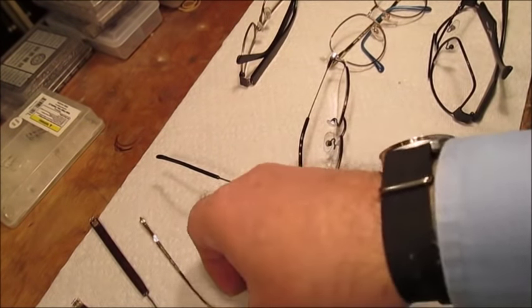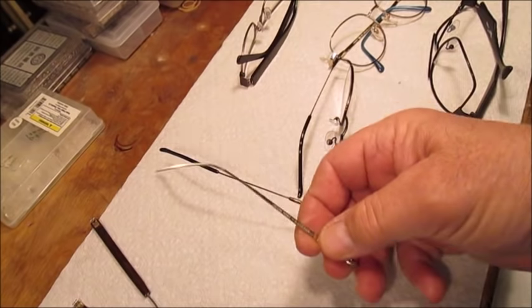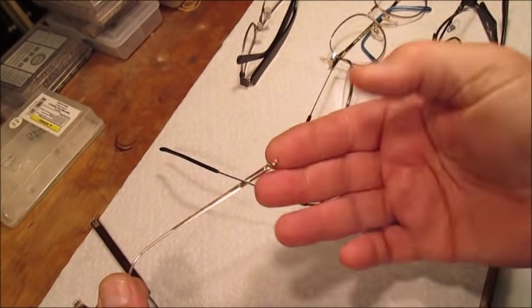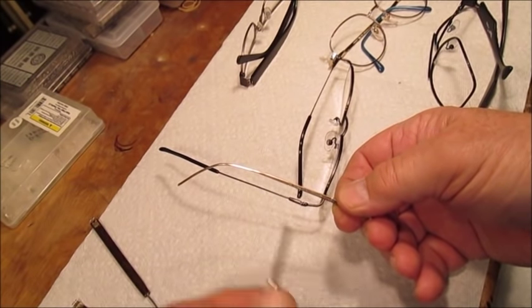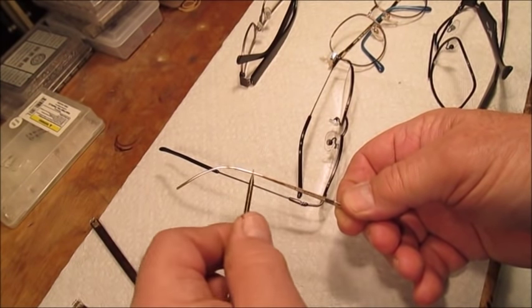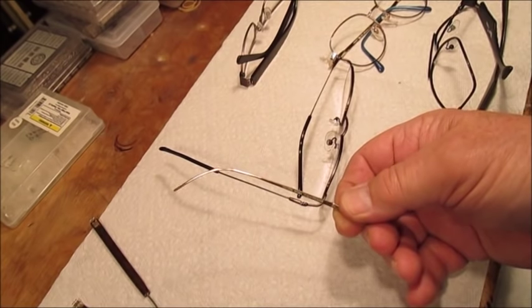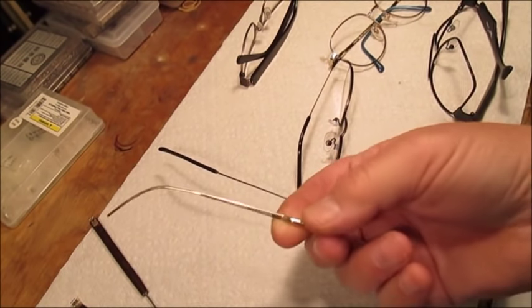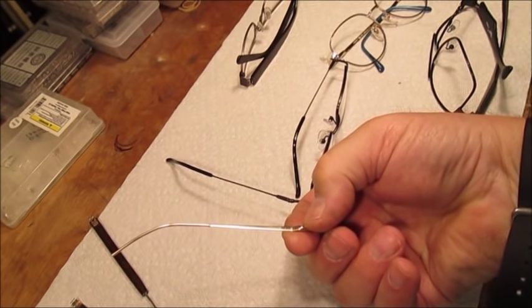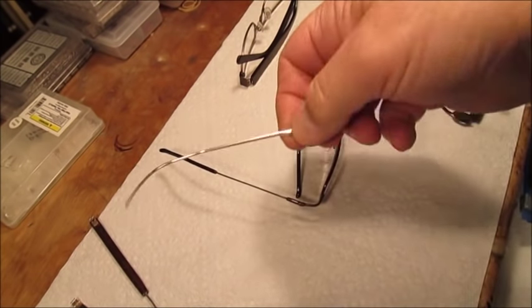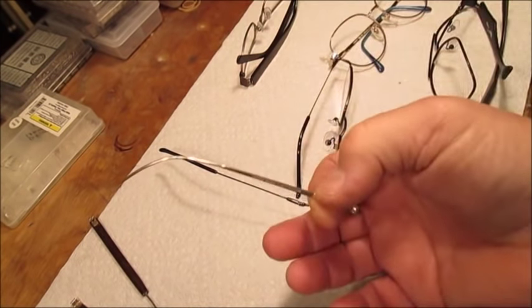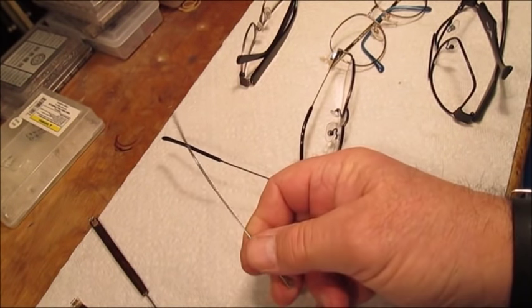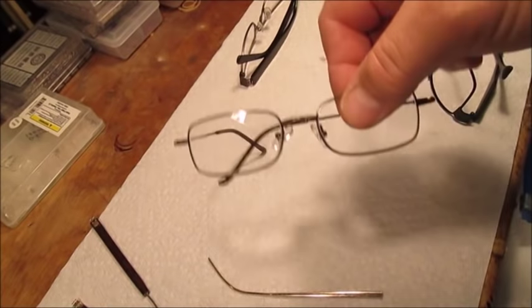Then we have the actual temple arm itself which extends back from the attachment point, goes back over the ear, and has to be welded at one of the points at which it tends to break. Again, sometimes this is the result of adjustment, sometimes it is the result of just common everyday wear. But in all cases as long as you have most of the piece remaining we can in fact replace it or repair it and return the frame itself to service.